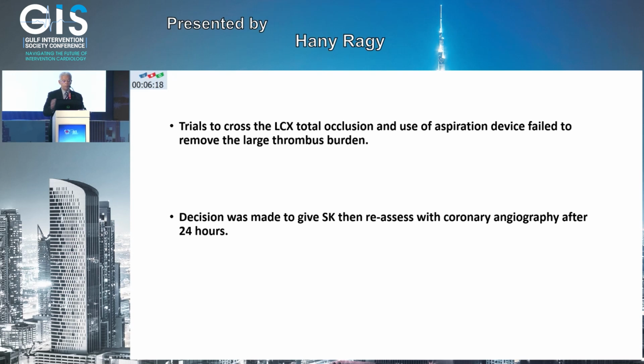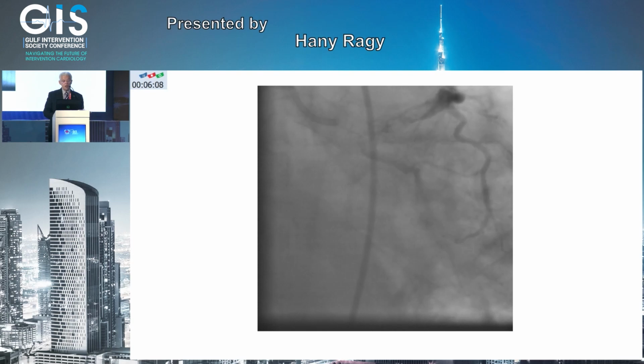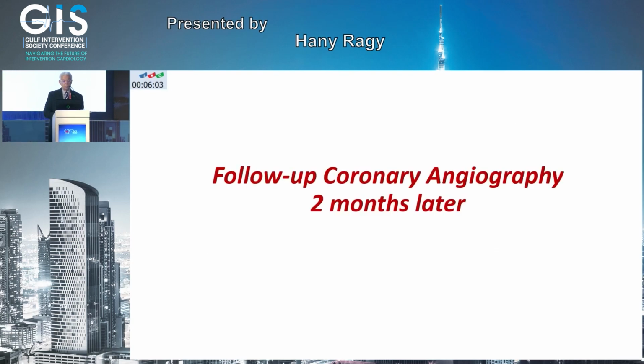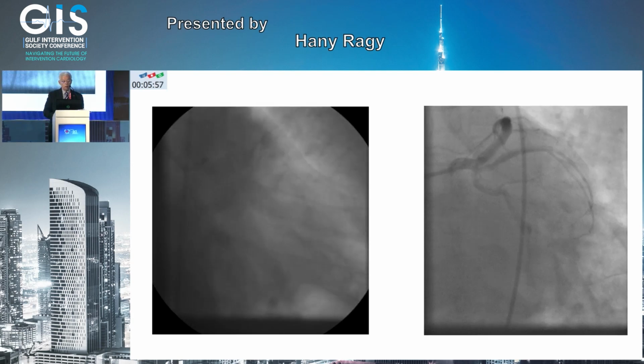The patient was kept on pharmacologic treatment and assessed later, and had some flow. The ventricle was good. The patient had become asymptomatic. The patient was left, and 2 months later was angiogrammed and IVUSed and was doing well.